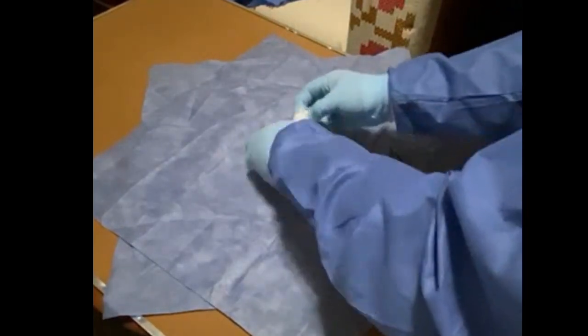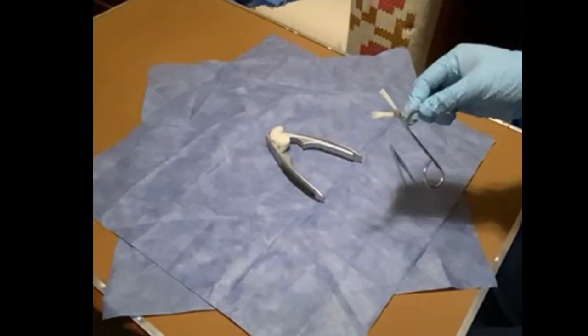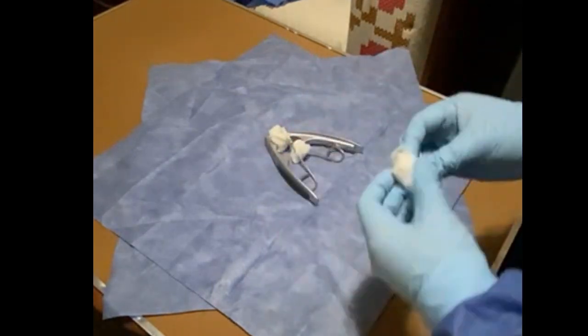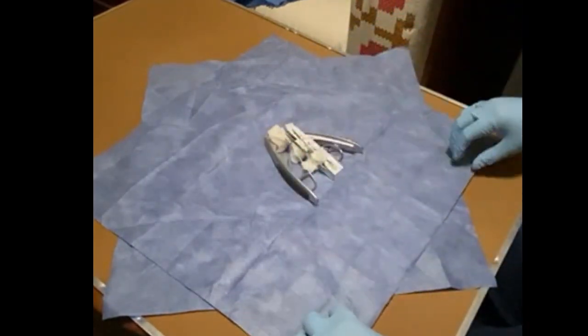Select an appropriate size of wrapping paper that allows for adequate coverage of the instrument tray or individual instruments, with enough material left for secure folding. Place the instruments in the center of the wrap, ensuring they are arranged in a functional position.